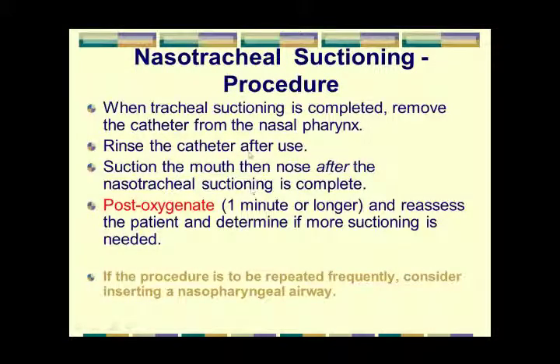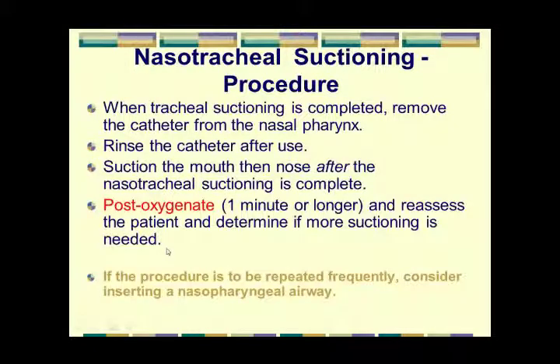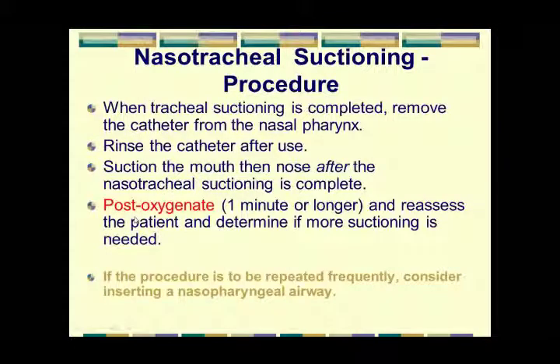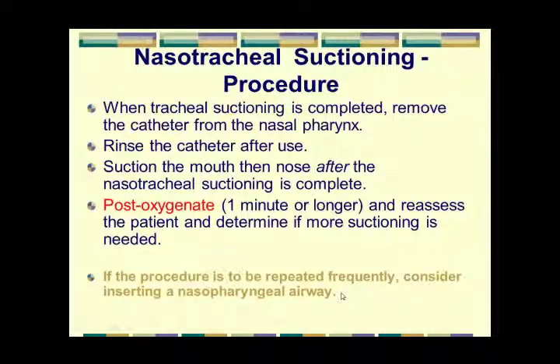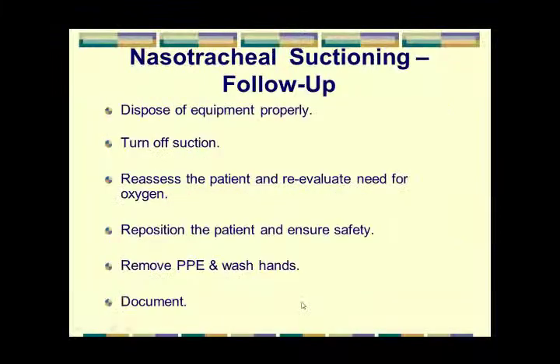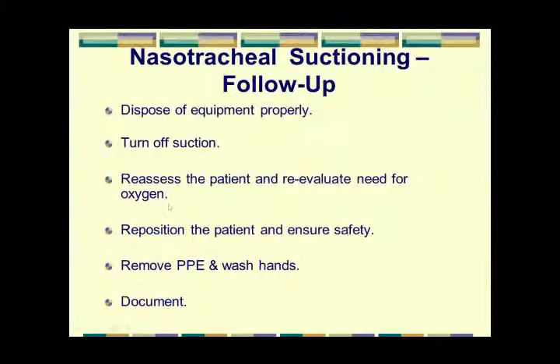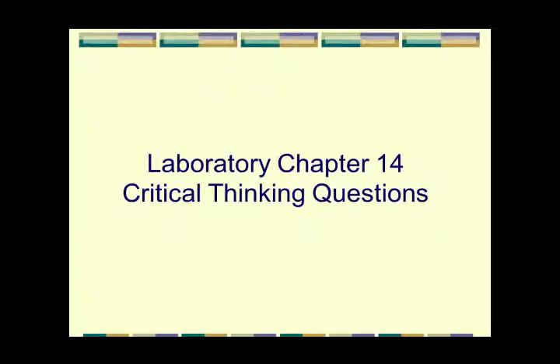Once we're done, remove the catheter, rinse it, and then once you're finally done, go ahead and suction the mouth after you're complete with attempting to get into the trachea. And then after the procedure, post-oxygenate them and make sure that their heart rate has returned to normal and the respiratory rate has returned to where they were previously. And that last bullet point makes logical sense. Get rid of the equipment, turn off the suction, reevaluate, and so on. All the things you would expect. Okay?